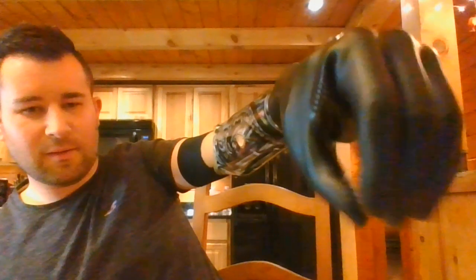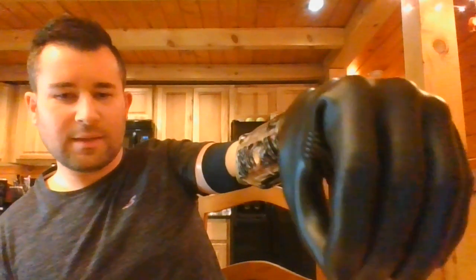This hand has two programs or two grip patterns. The first is lateral mode — you can see it closes up against the index finger, and just like that it opens and closes. If I flex both muscles — the open and the close signal simultaneously — it changes the mode. The thumb moves over and now you're in an opposition grip pattern.